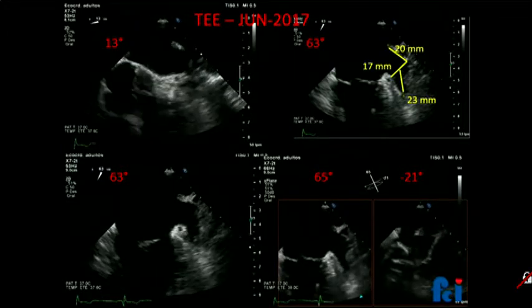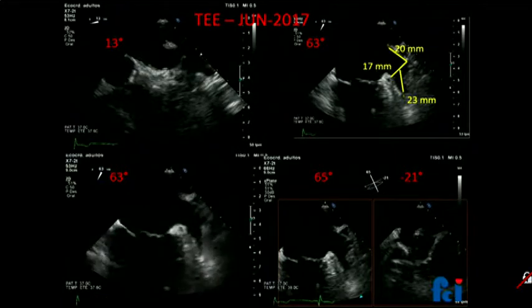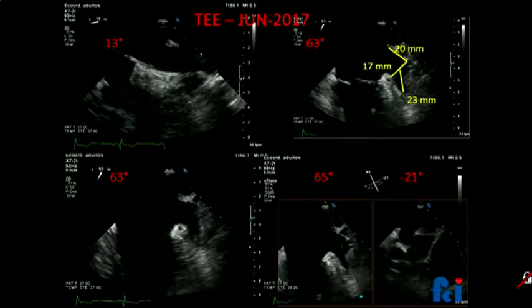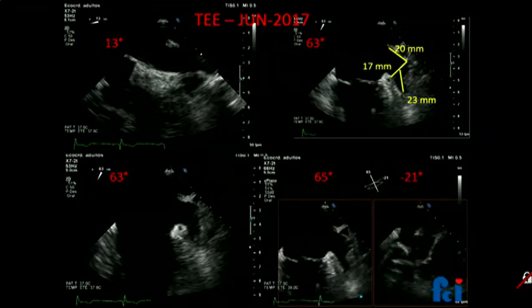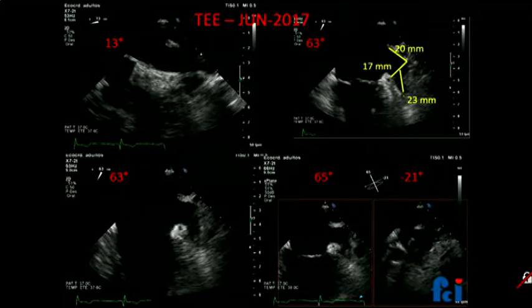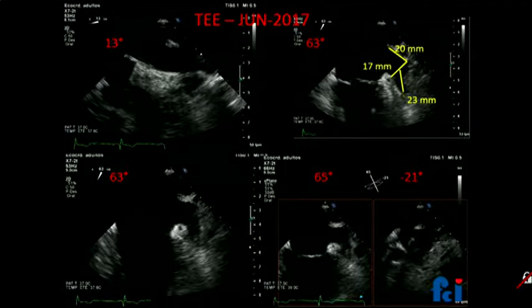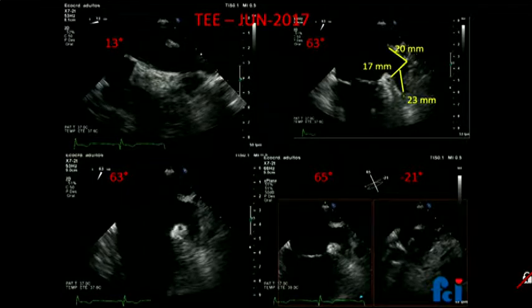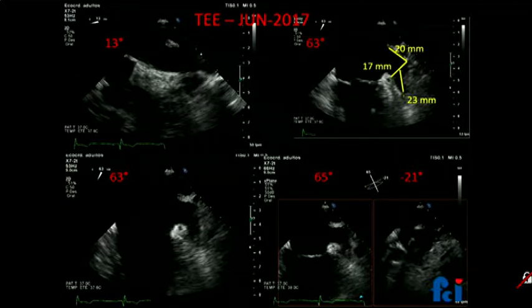This is the most important view when deciding the type of device — this is the circumflex. When measuring the device, the measurement is in the back of the appendage, but you must visualize the device sitting flat — the real depth is in the perpendicular direction. When you deploy the device, if there is not enough space, you will have a shoulder in this area which results in leaks, because not all the device will be coated with the necessary material to cover the appendage.